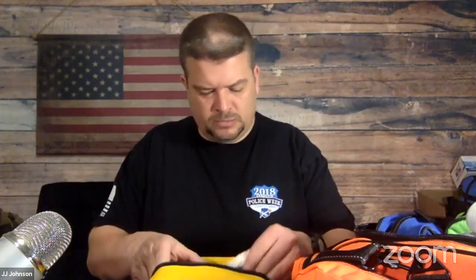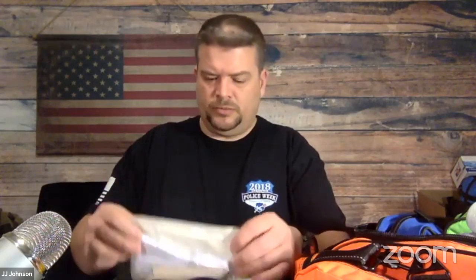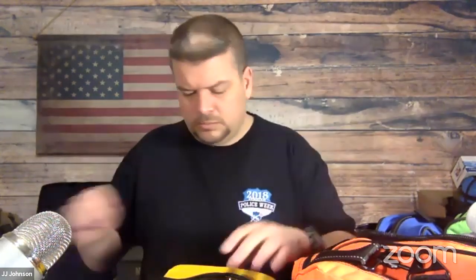So this one is kind of the battery's all nasty. That's good to know. Let's replace that. So this is kind of the tools section, I guess, for the most part. So find a place to put this stuff. Sorry. So you just got a pair of forceps sealed up. Forceps, no, those are tweezers. Excuse me. Tweezers. Then we've got a staple kit for stapling injuries. And we've got the staple remover kit.